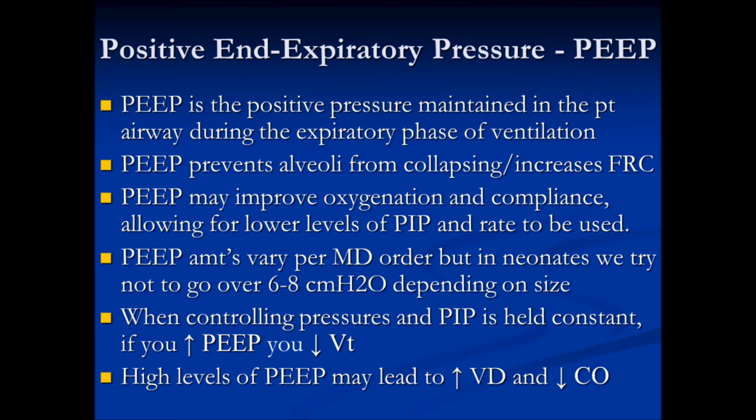When you have high levels of PEEP, you do not make way for there to be a lot of time to complete that breath, and therefore the next breath you end up with all of that dead space that was not used for ventilation.